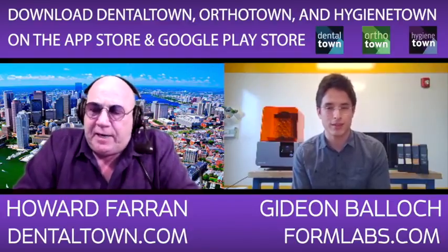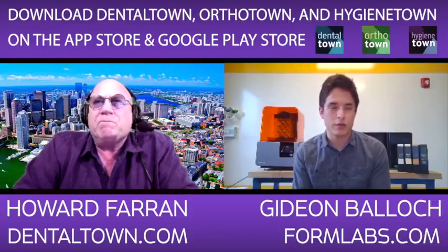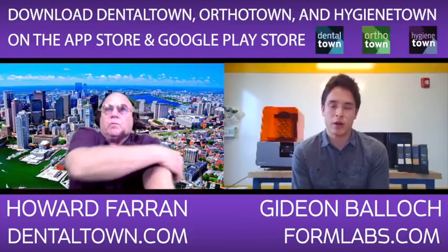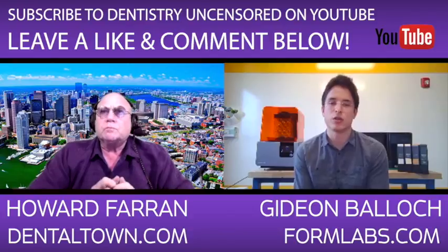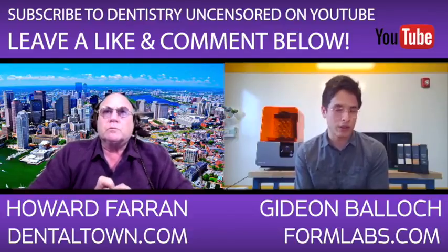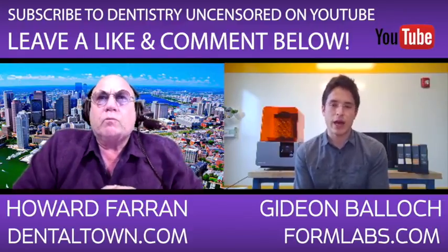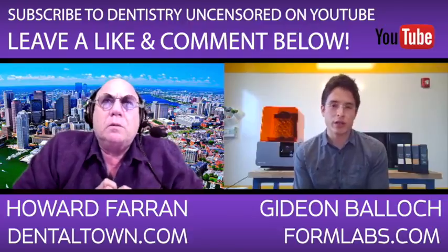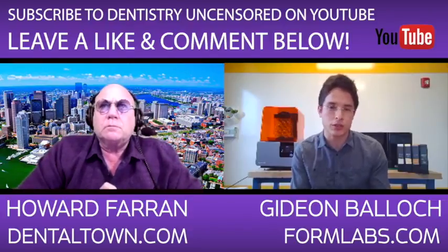What about their Scandinavian brother, Helsinki, Finland, Planmeca? Are they leading in oral scanning? Planmeca makes a very good scanner, and I think the general trend right now is that pretty much any scanner that you could buy on the market is going to get you clinically very good results. There's going to be some differences in terms of wireless versus not wireless. There's definitely a difference in terms of costs across the board. So in terms of accuracy and quality, I think a lot of the companies are up there. Where 3Shape might have a slight difference is that there's a bit better polish with their software, and it can come through the stages a little bit more easily.